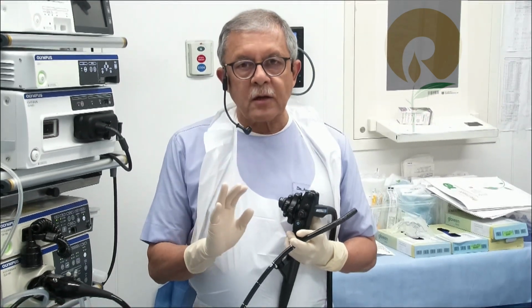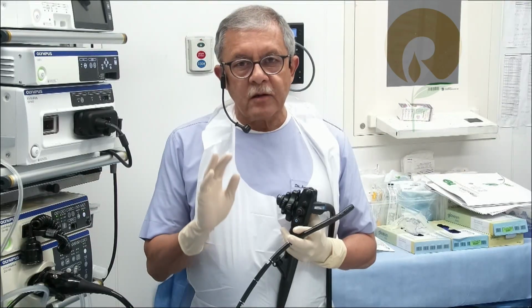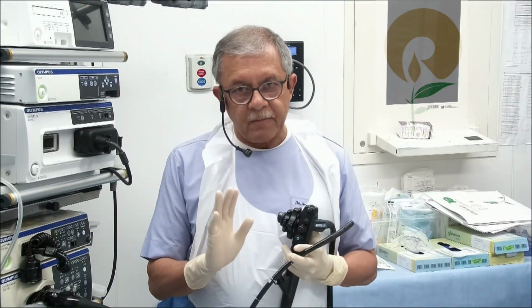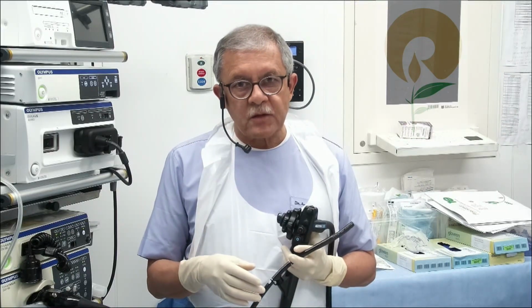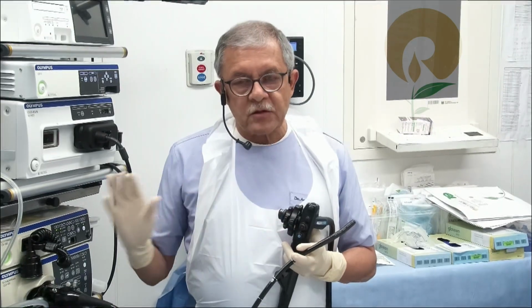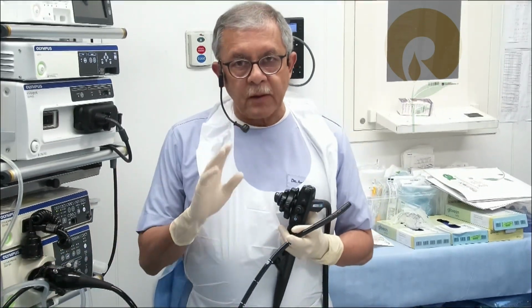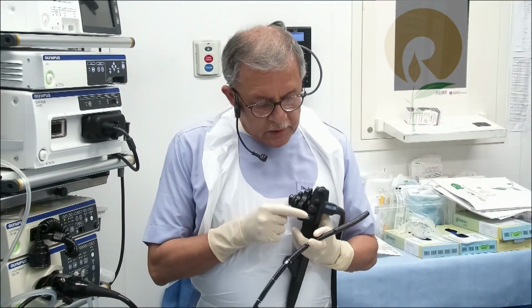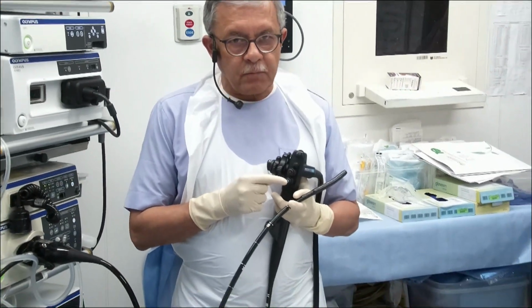In normal circumstances, for normal upper GI endoscopy, we insufflate regular air, unless we are performing some interventional procedures where instead of room air, we instill carbon dioxide. So, air is continuously coming out from this button.